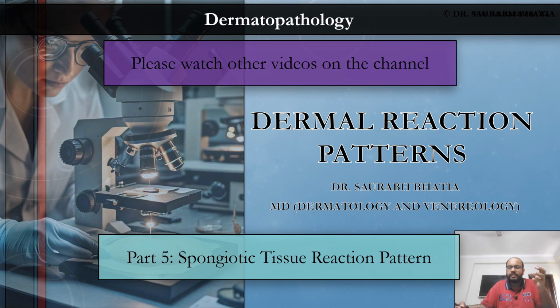Spongiosis is, I would say, one of the easiest patterns to recognize. But remember that at multiple times, it can be very subtle. It can be a difficult pathological feature to look for, and you might require multiple sections. In fact, you have to examine the other sections on the slide so that you do not miss spongiosis in one of the sections.